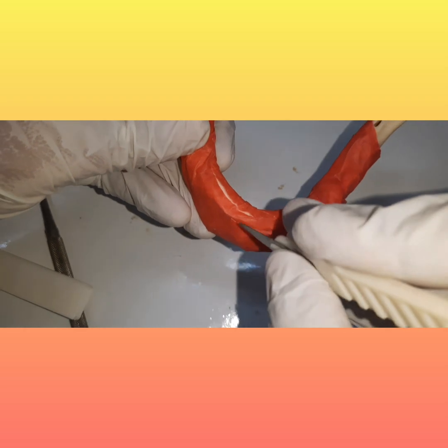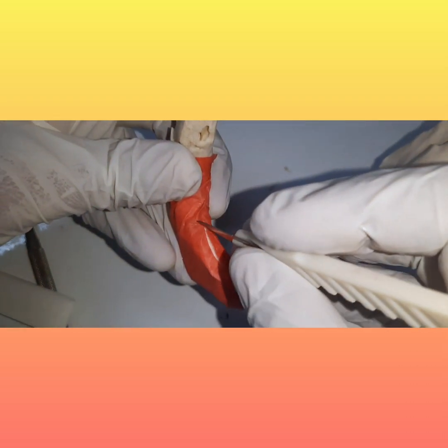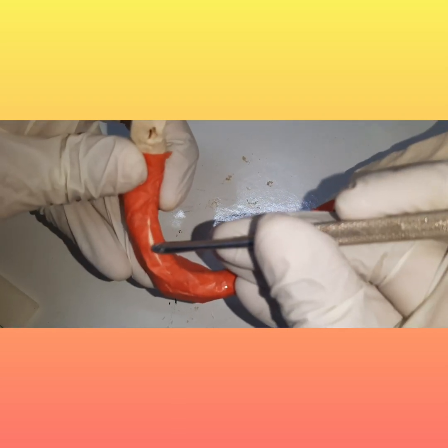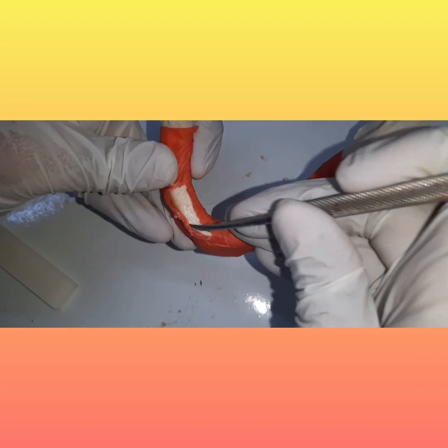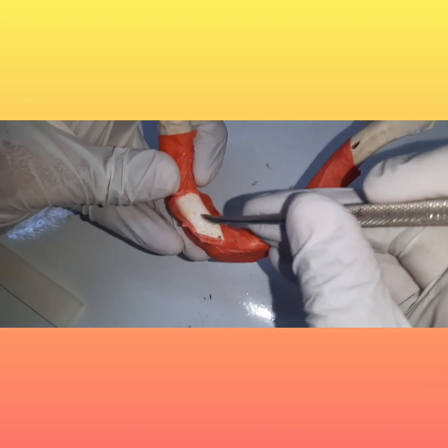After that, you can give vertical releasing incisions if you want, like this, or just a minor vertical incision so that it helps you in reflecting the flap. So you will be using a periosteal elevator, and you're just going to reflect like this. Avoid reflecting too much of the lingual flap.